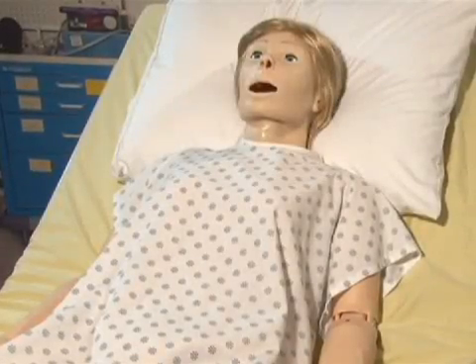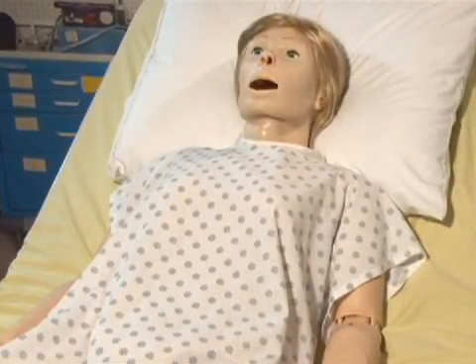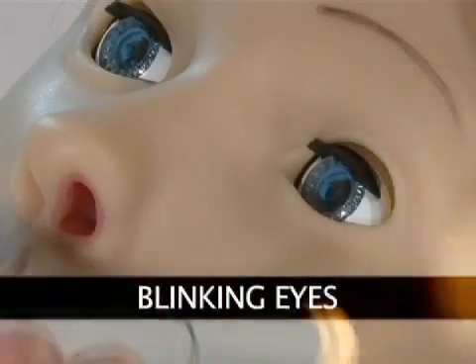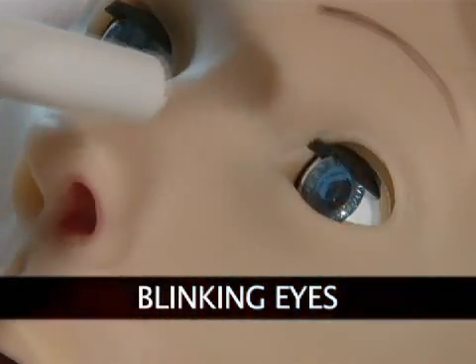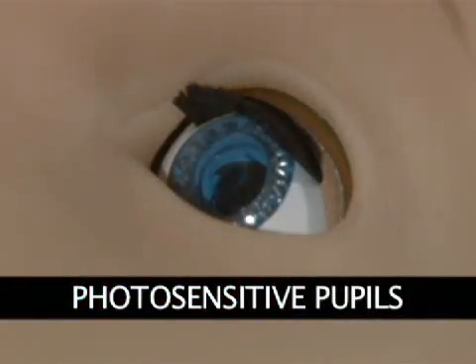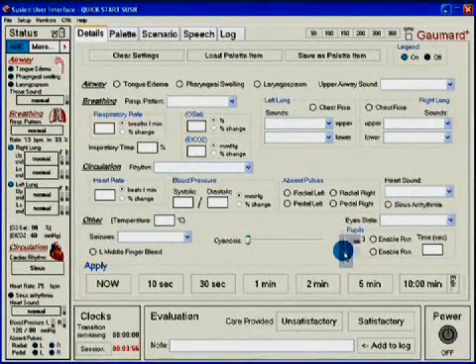Now that your Suzy Total Mobile Solution Simulator is ready for use, let us take a tour of her many features. State-of-the-art total control blinking eyes with photosensitive pupils — the dilation state of the pupils, the blinking rate, and light reactivity are easily manipulated from the tablet PC, giving the user total control.